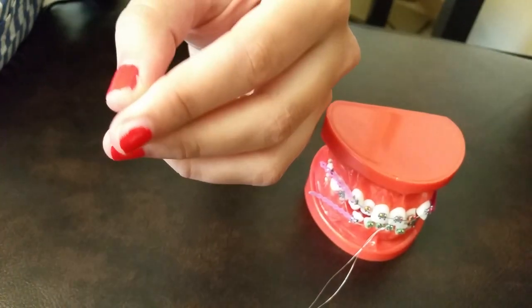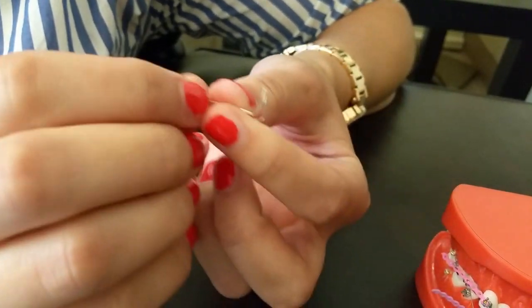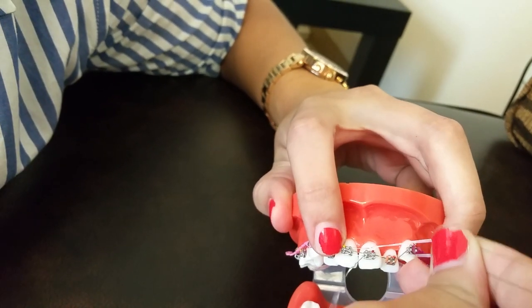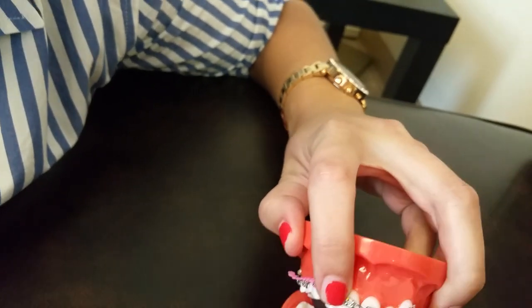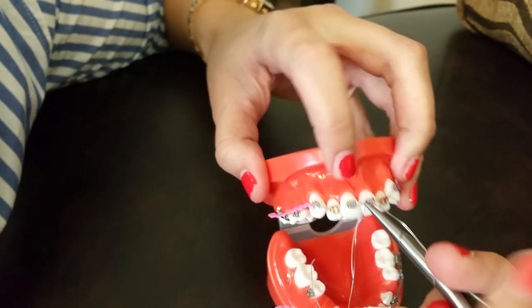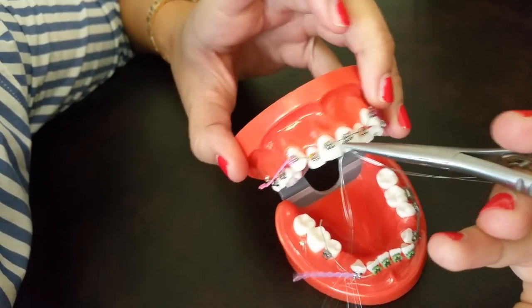For the other one: squeeze, make a small bend at the end and a 90-degree bend, go in towards the other side, make sure it's snug, make sure it's under all corners, and twist. It's easier on a patient because you don't have to hold the actual mouth. Twist until you get a little shake — you're good.